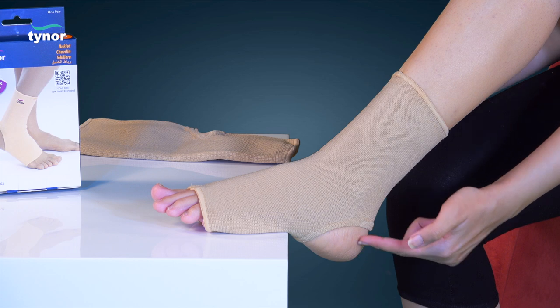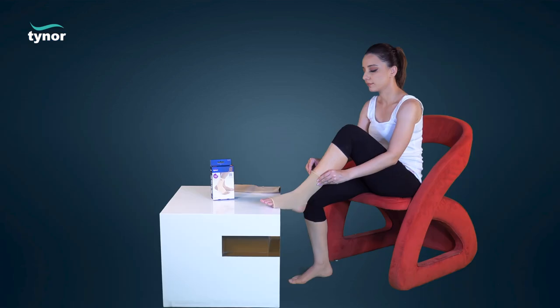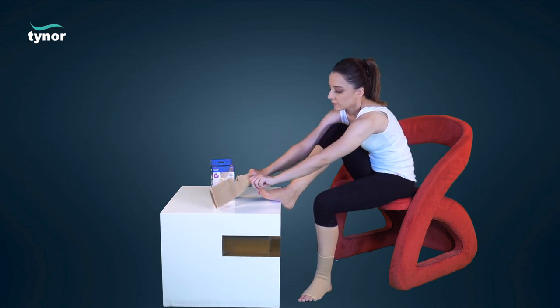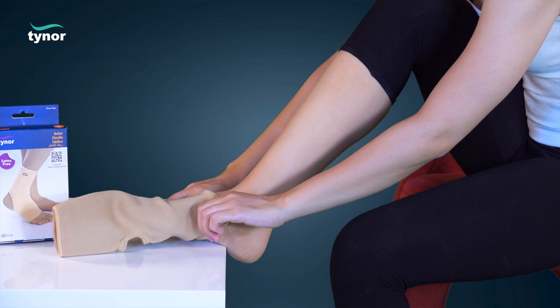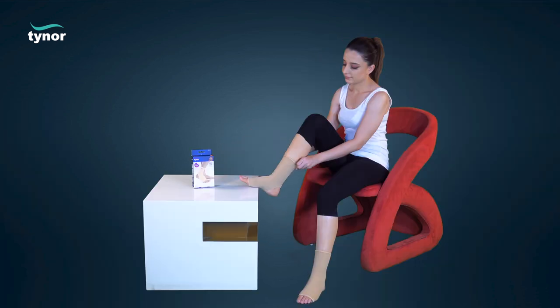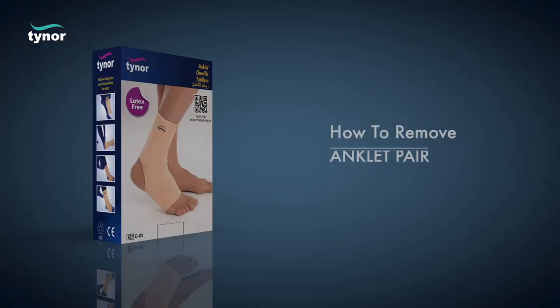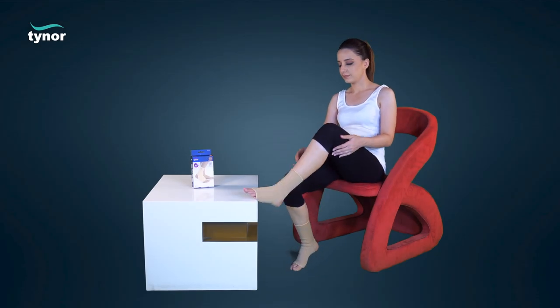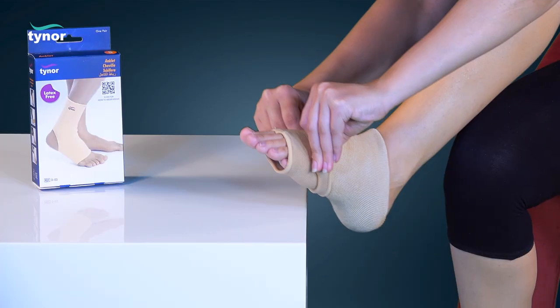Align the opening portion around the heel. Now let us see how to remove the anklet pair — pull down the product with ease.